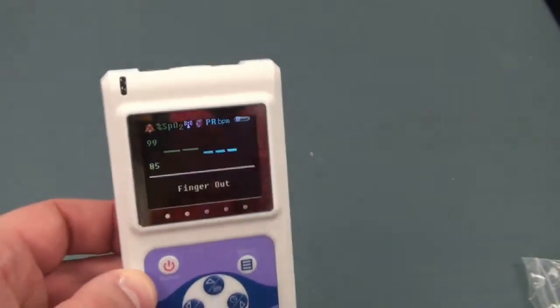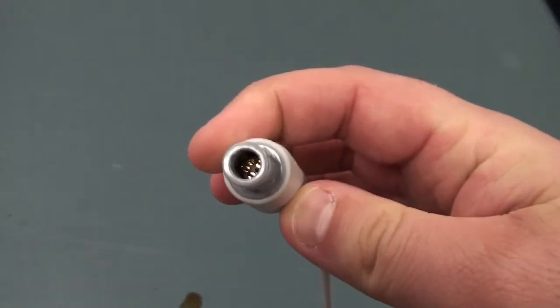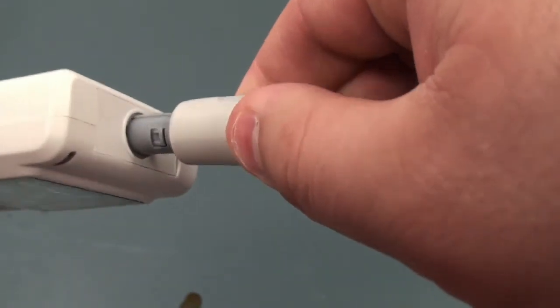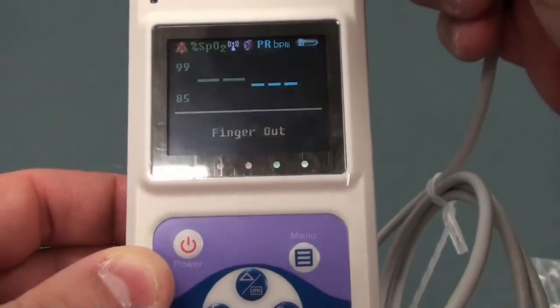To plug in the device, located on top of the device you'll see an input. On the probe, you'll see a groove side. Stick the device groove side in, and the device is plugged in.